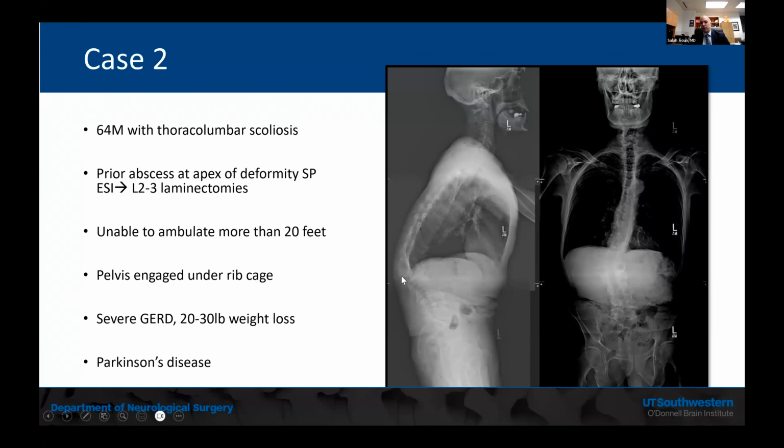So if you're putting S2AI pelvic bolt screws, it's important to localize these foramina, and you can lose a lot of time, even with navigation, if you don't have an idea where you're going. And this is a picture of him in the OR. You can see the model is life size. It kind of reflects his scoliosis there.